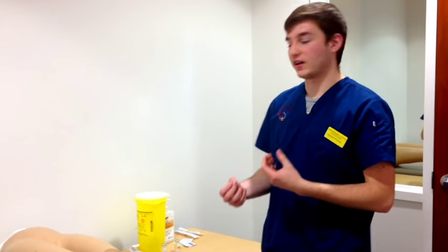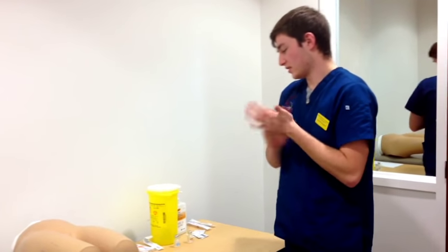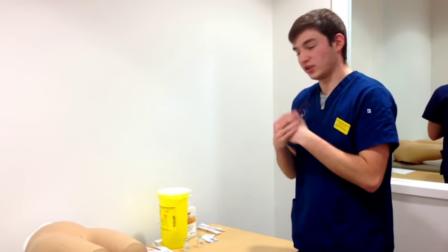So I'm going to be telling you the steps, from the beginning to the end, of how to draw the appropriate medication from a vial, as well as how to give the medication subcutaneously and intramuscularly. The first step is hand hygiene. The second step is looking at the MAR.